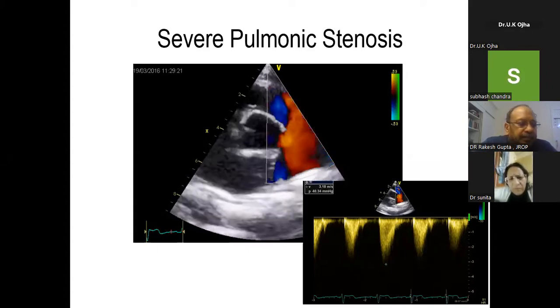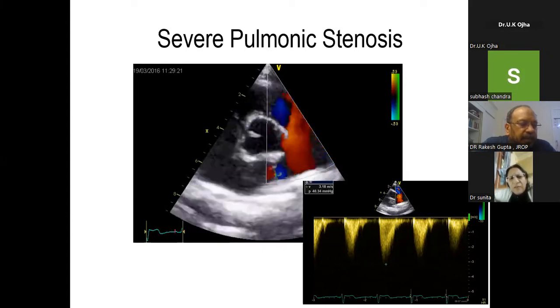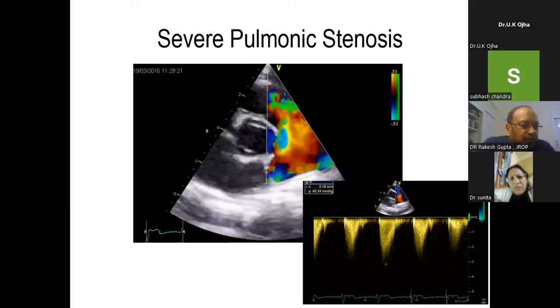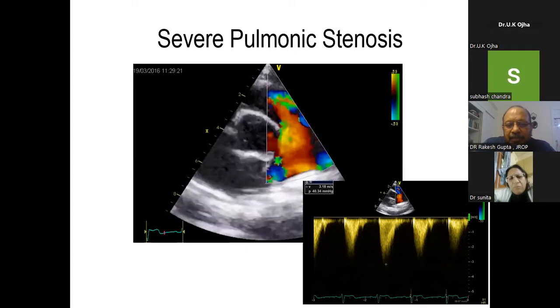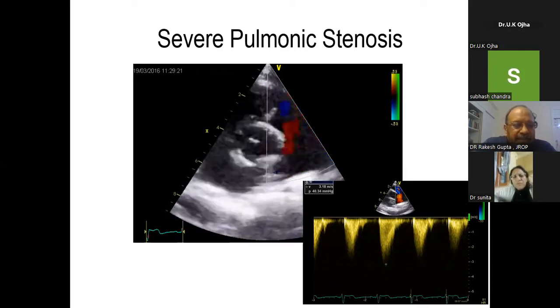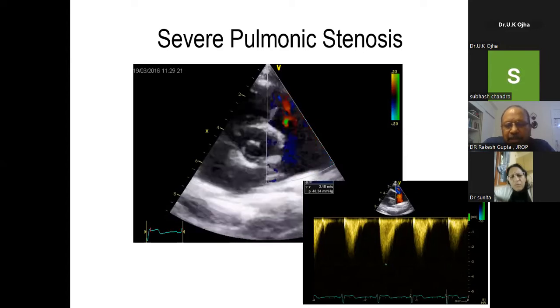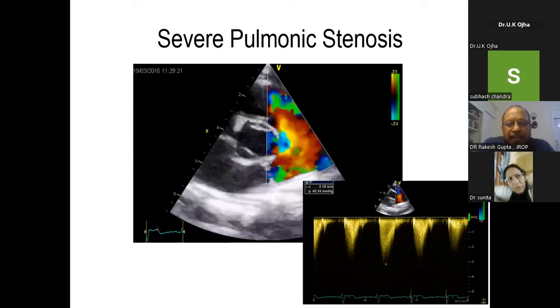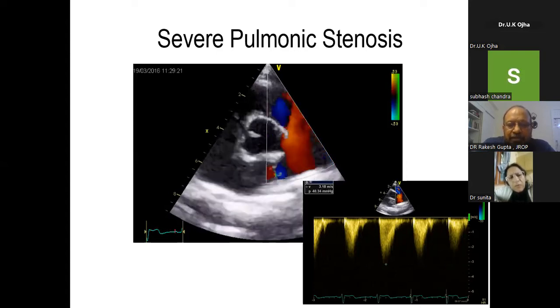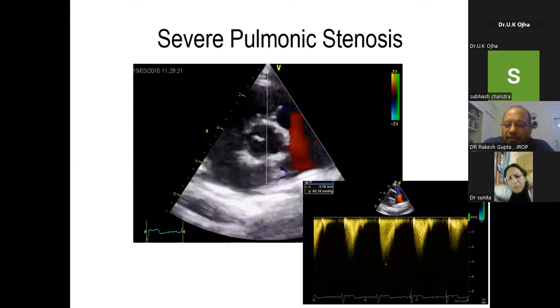If somebody has a diastolic dysfunction, does it affect that? The majority of AS patients will automatically go to diastolic dysfunction. It will not affect the measurement, but when AS is present, LV relaxation will become poor because of hypertrophy, and consequently the LA pressure will start building up automatically.